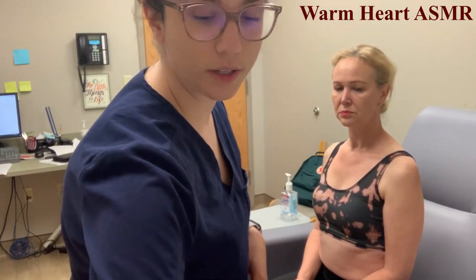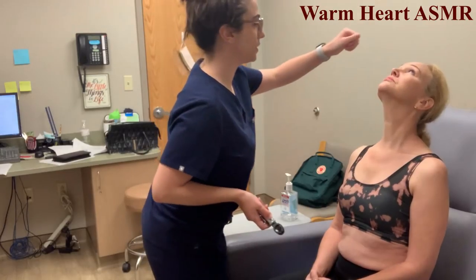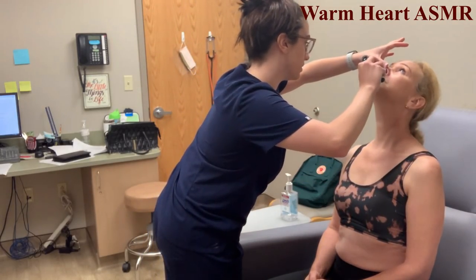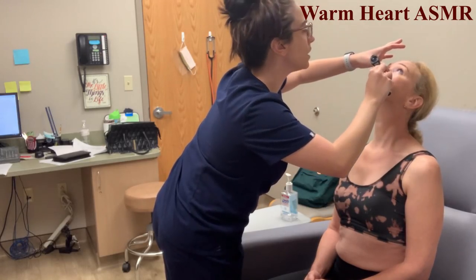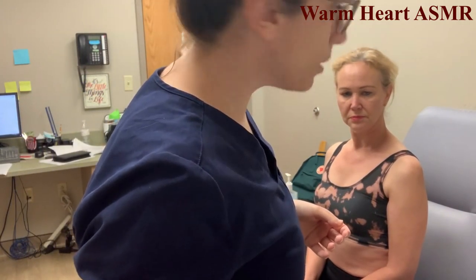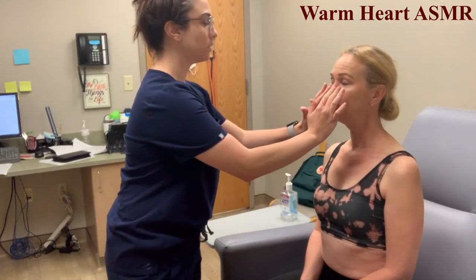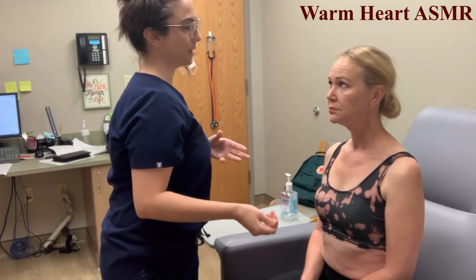I'm going to have the patient tilt their head back slightly. With my thumb I'll lift the nostril and take a peek with the otoscope. The turbinates are pink and moist with no inflammation or obstruction. Then I'm going to palpate the nostril — any tenderness? No.